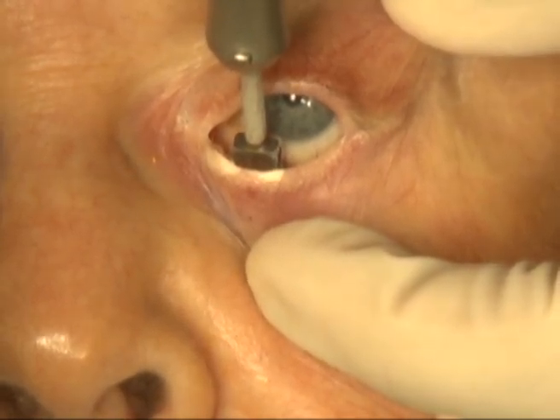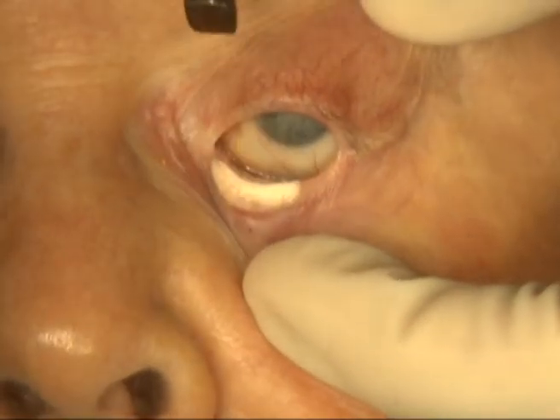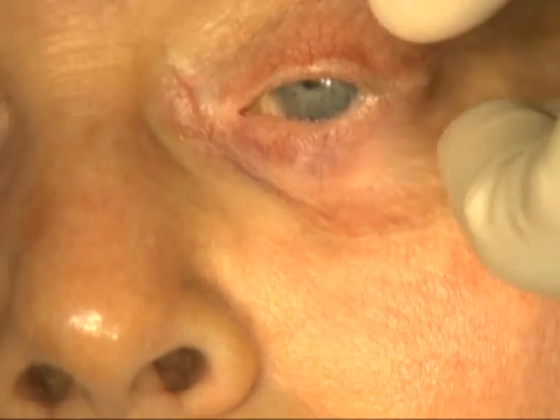In order to attain destruction of the lash follicles, a double freeze-thaw is performed. After complete thawing, the cryoprobe is again placed in the area medially.